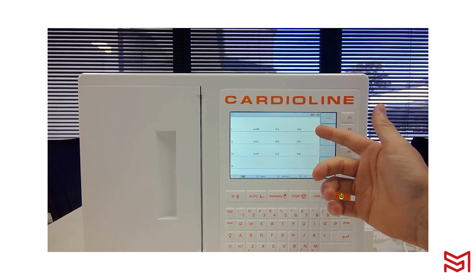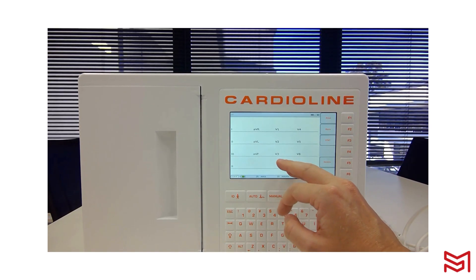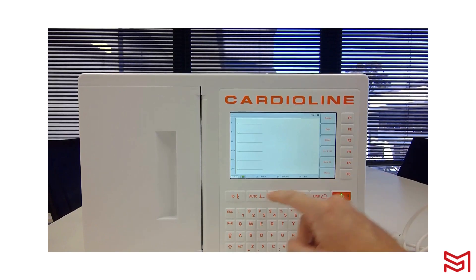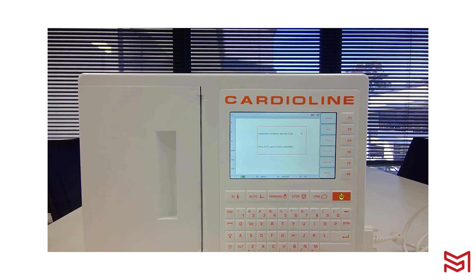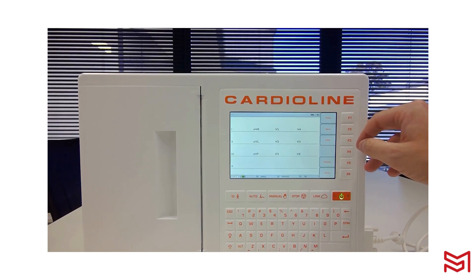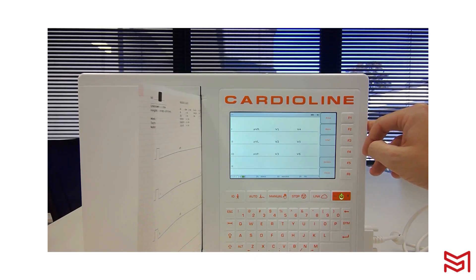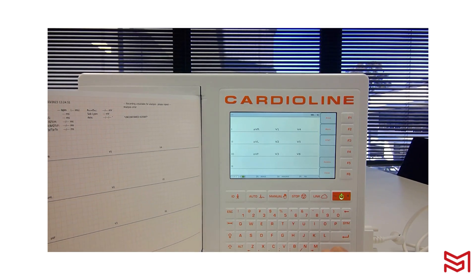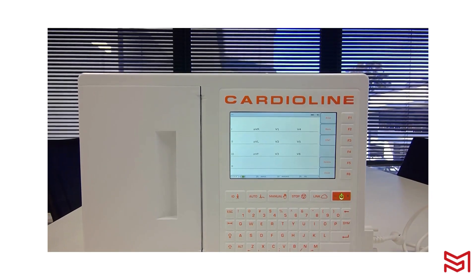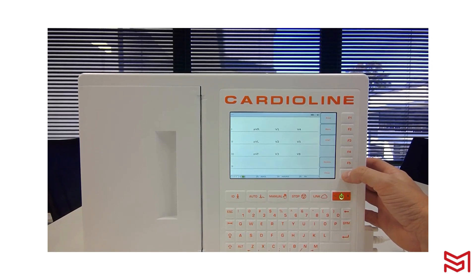If I hit Print, it will automatically print for me. But if there was an arrhythmia, artifact, or something on the trace I didn't like, I can close that down and redo the ECG without wasting paper. I'll capture an ECG again — this time I'm happy with the trace quality — and hit F1 to print the report. This is a nice backup to avoid accidentally printing if you press the wrong button. Once the report has been printed, it will also save in the back end so you can export that data.